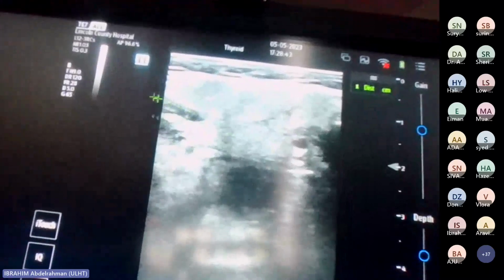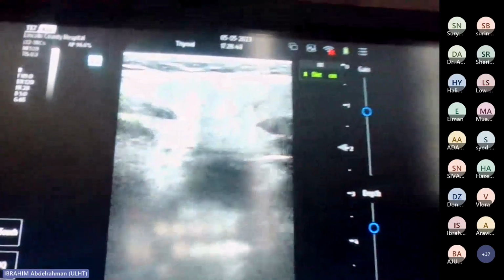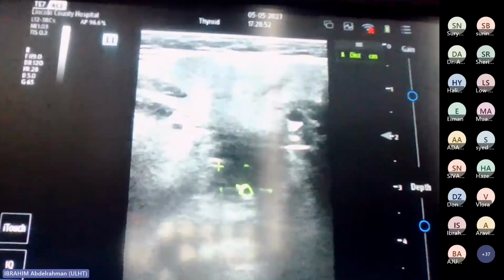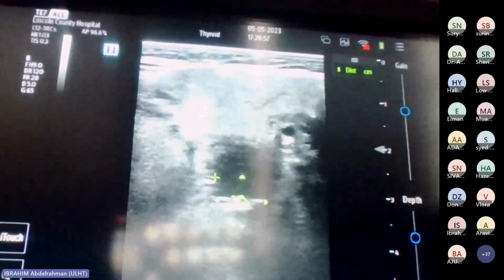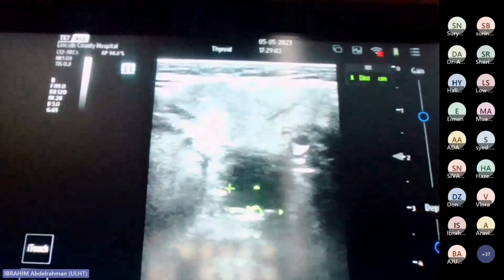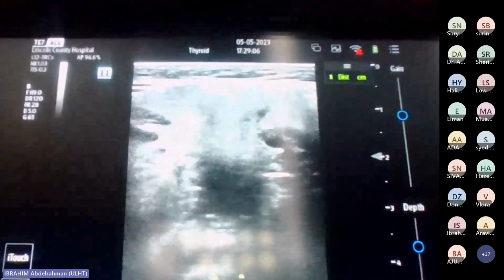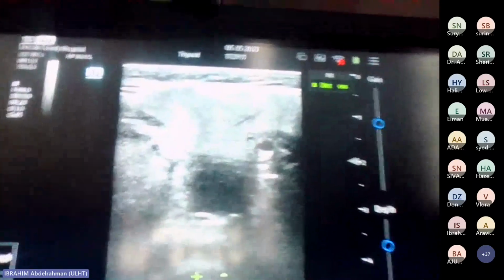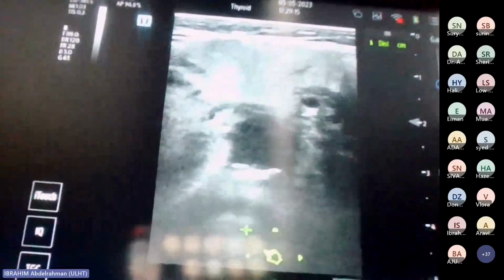So the submandibular duct will pass between these two, and if it's dilated, that's where you will look for it. Just inferior to the submandibular gland is the tonsil. And again, you wouldn't see a small tonsillar tumor, and we wouldn't use ultrasound for staging of oropharyngeal cancers. But if there is any associated lymphadenopathy in level 2, then we would certainly look at the tonsil and the base of tongue to see if we can see any abnormality there.